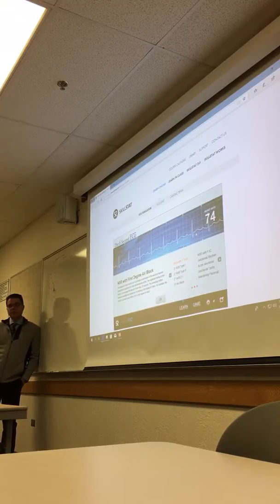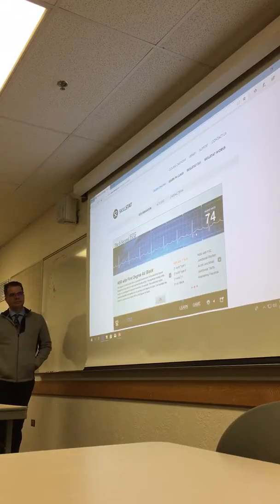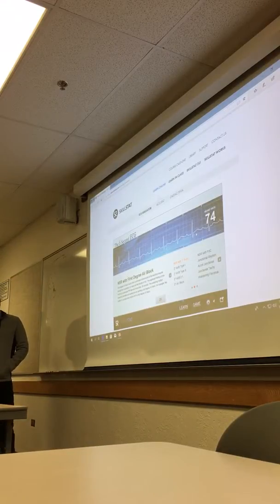We saw one yesterday that was 0.36. It was almost 2 boxes long. It was cool. Okay, so that's your first degree block. You do not have any missed QRSs, and you'll notice your Ps are marching out and your QRSs are marching out. Just a long PR interval.